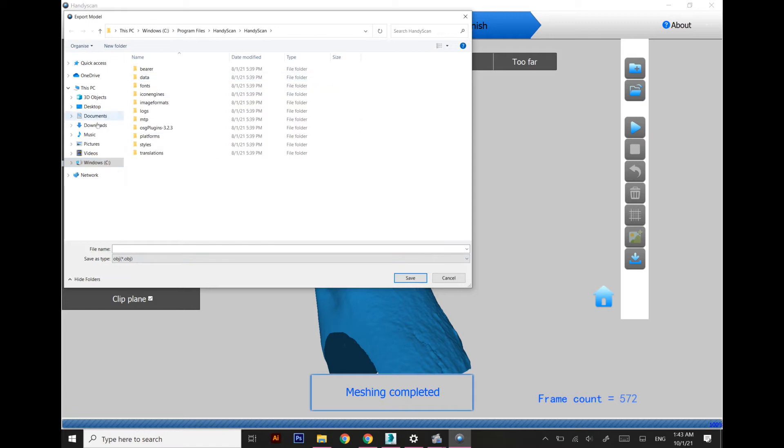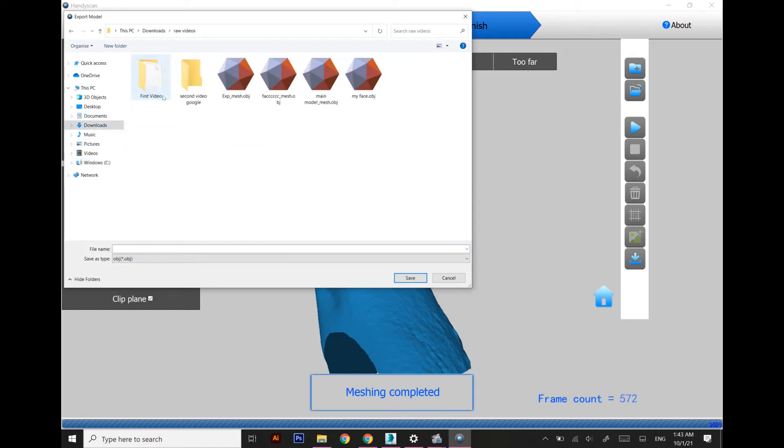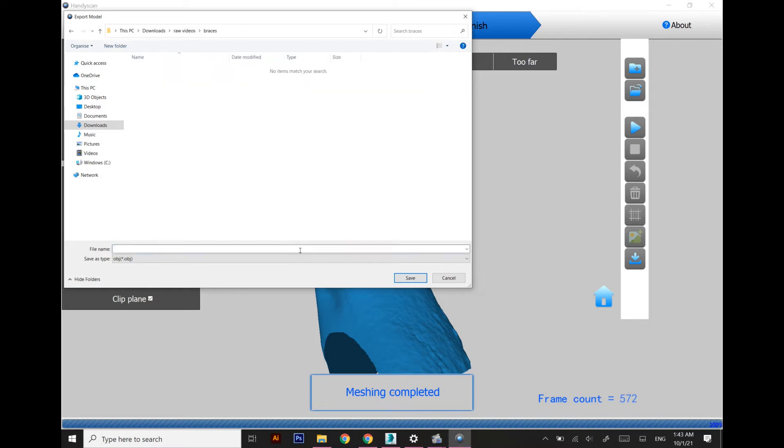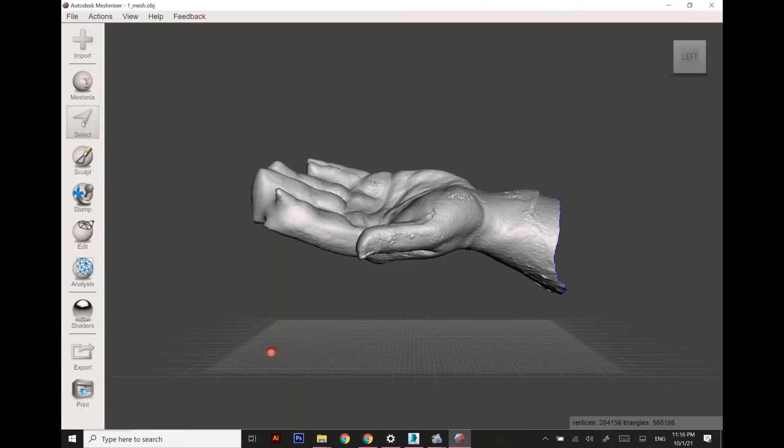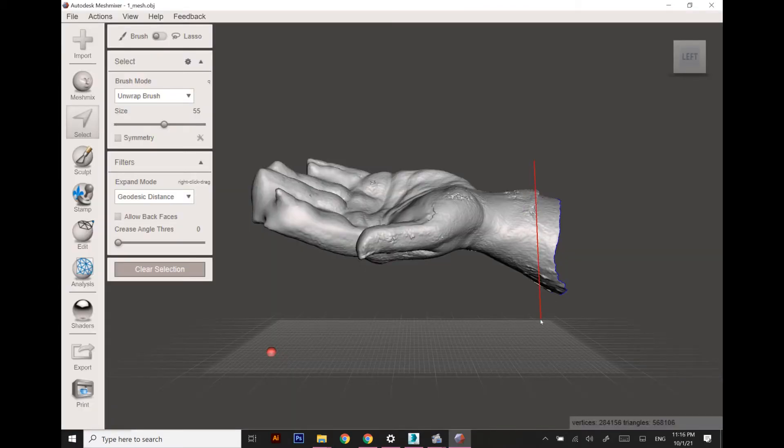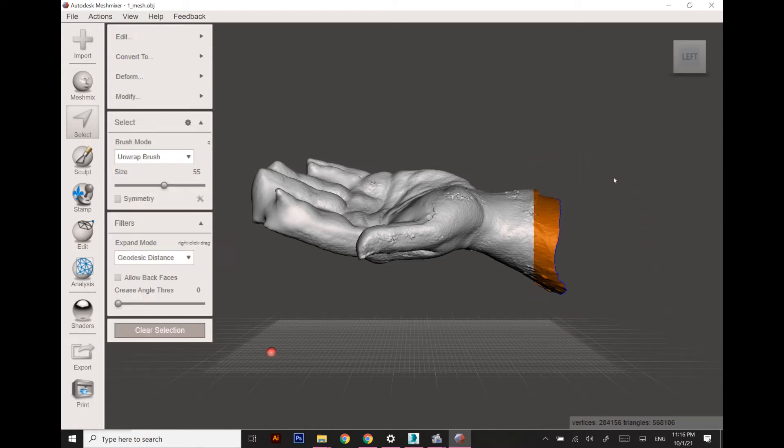Once the model is exported, I'm going to import this into 3ds Max for designing the splint. But before going into 3ds Max, we have imported the model into Meshmixer to remove the unnecessary areas which we are not going to need while designing the splint.